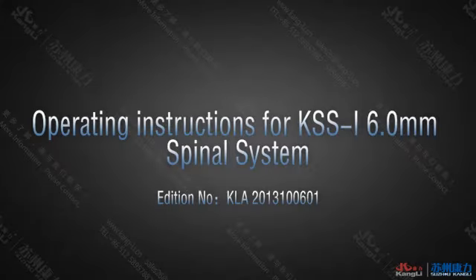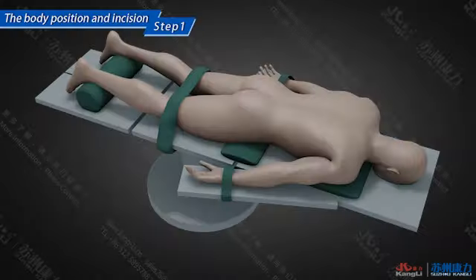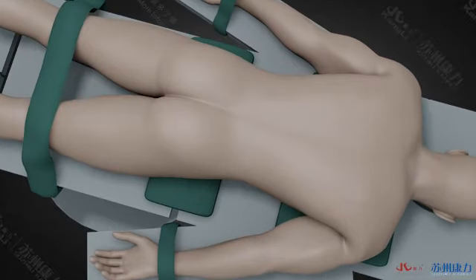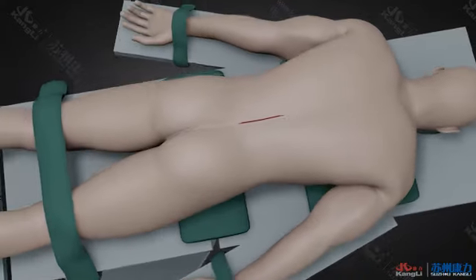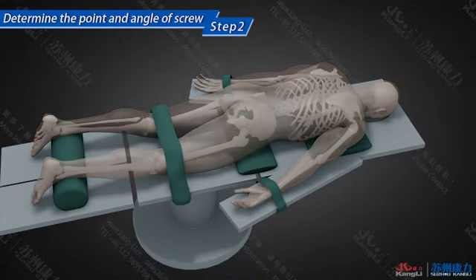Operating instructions for KSS-I 6.0mm spinal system. Step 1. The body position and incision. Let the patient lie on the bed. Take prone position. Fix the upper limb temporarily. Make an incision in the midline of the back and determine the position and length of the incision according to the damaged segment.